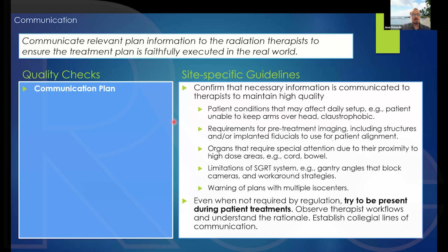All right. So it's always important to communicate with your team. I have some examples here of situations in which you should be communicating. My recommendation to you is to try to be present when you can during patient treatment. That will give you the opportunity to observe the therapists when they're setting up patients and working with the patients.